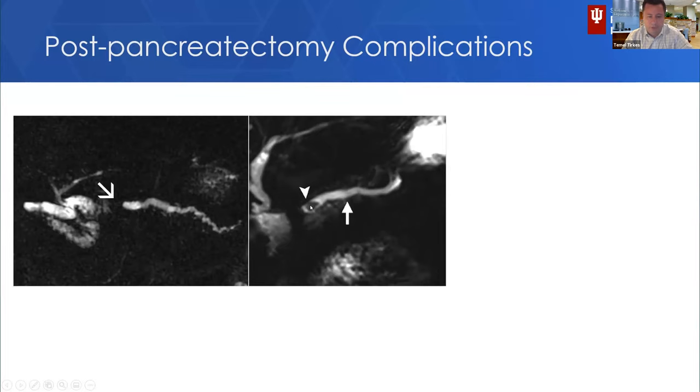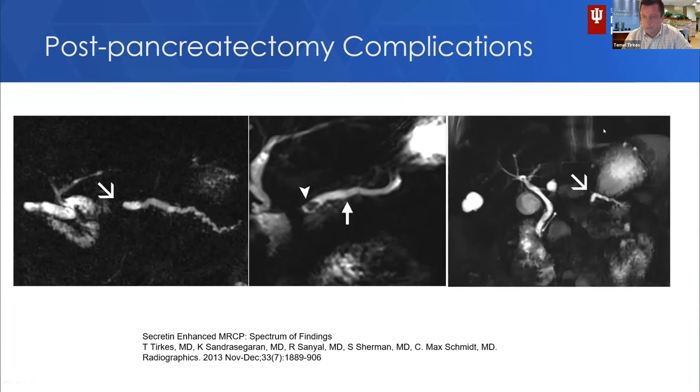The second case here is also a stricture at the anastomosis, but in addition to that, there was an intraluminal filling defect, as well as ductal dilatation of the pancreas. And the third image is not from a Whipple procedure, but from a central pancreatectomy. As you can see, the central part of the pancreas is missing. And in these patients, there is one anastomosis between the upstream or tail pancreatic duct and the small bowel again. But in this case, it is also dilated. You can see the ectatic branches and dilatation relative to the downstream pancreatic duct. This was a stricture of the upstream pancreatic duct.